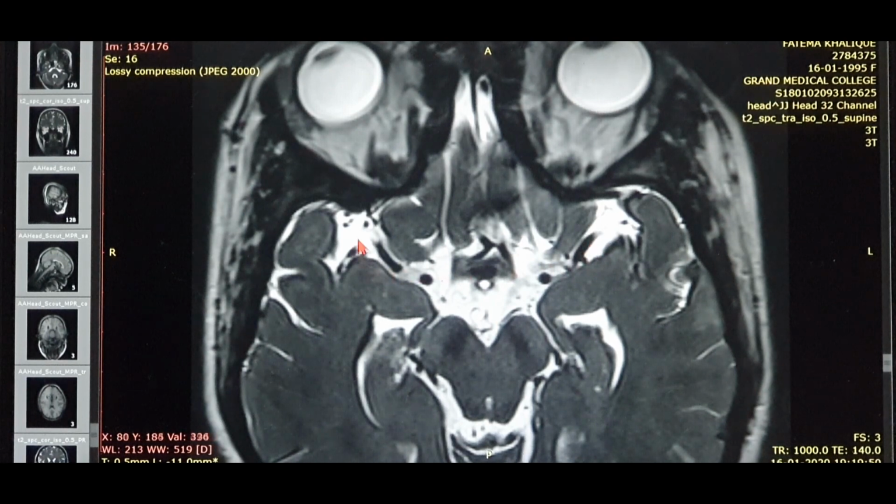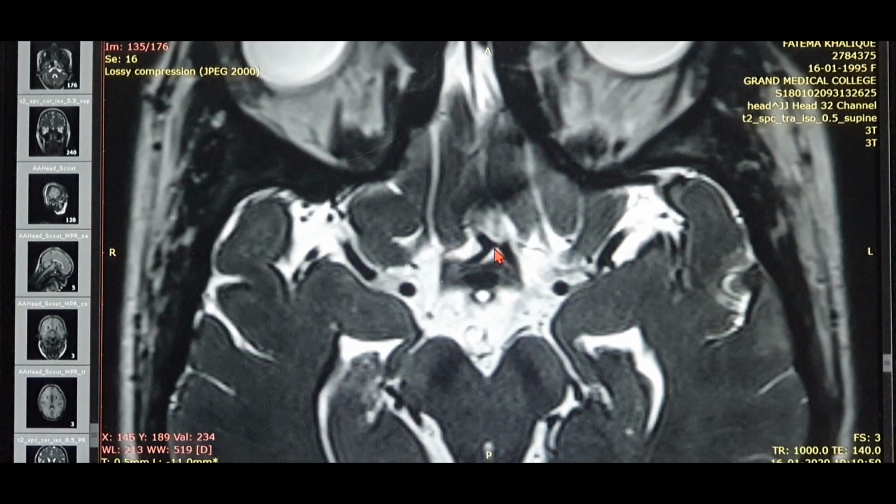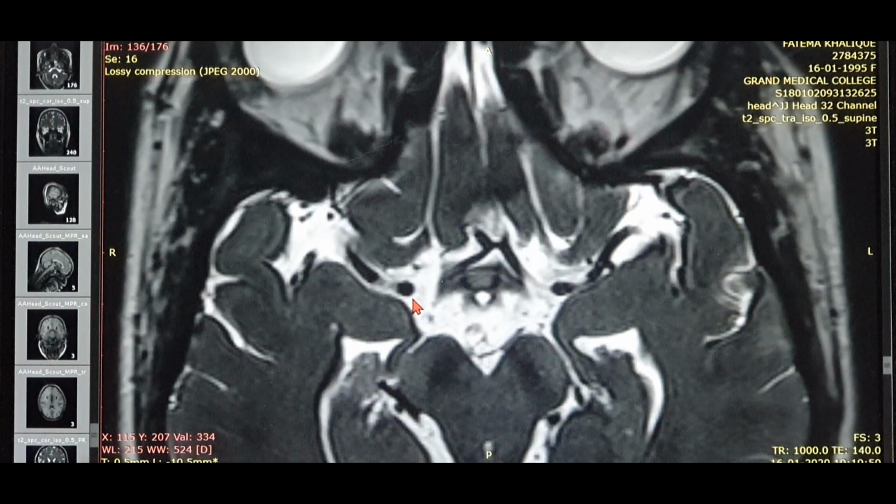and we can already start seeing the middle cerebral artery on both sides, and this is nothing but the Sylvian fissure. That's the Sylvian fissure, in which the MCA is always found. And you can also start seeing the anterior communicating artery right here. As you can see, that's the anterior communicating artery, that's the A1, that's the A2. So that's the internal carotid artery, which we will see dividing in some time.